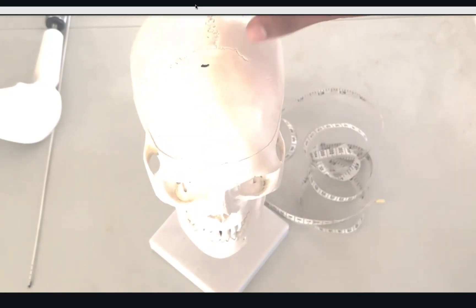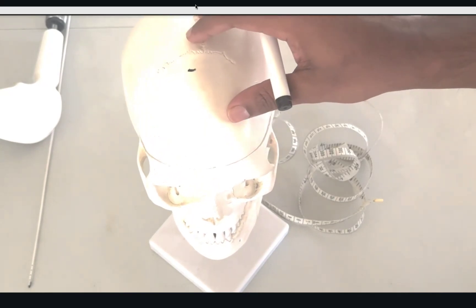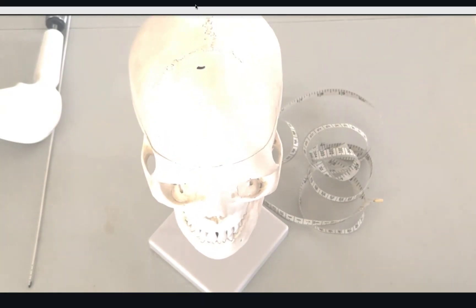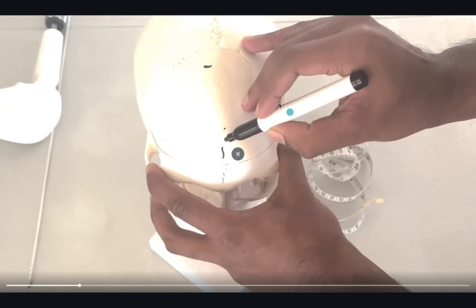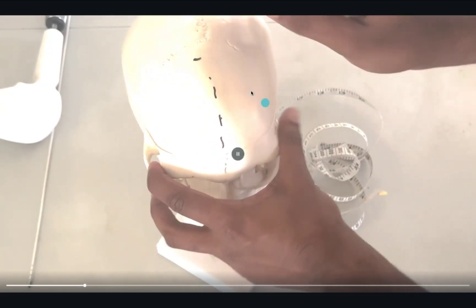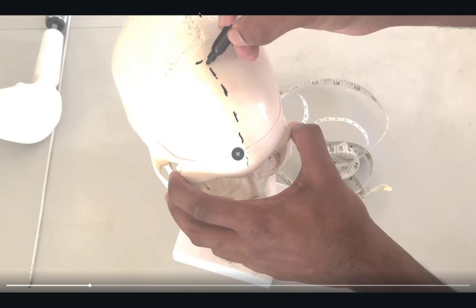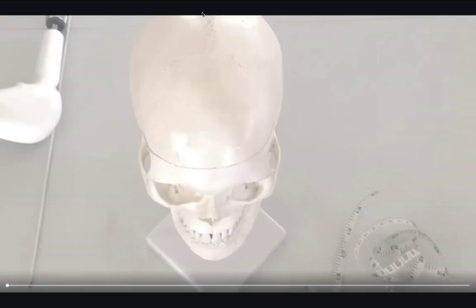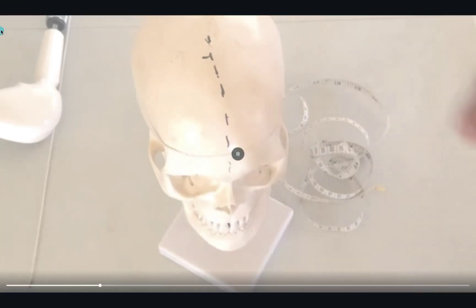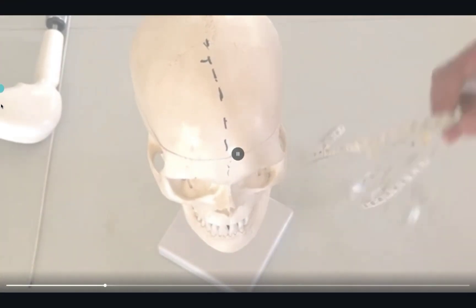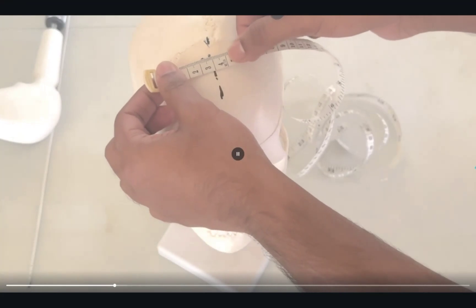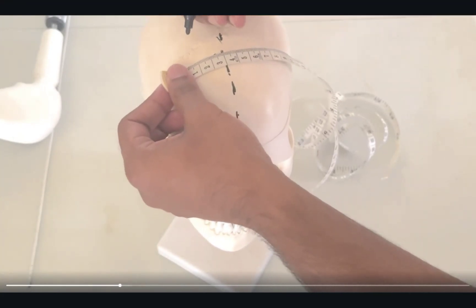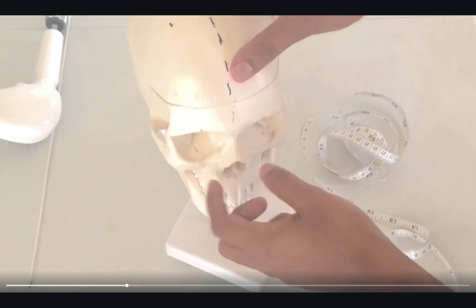It should correlate with being around one or two centimeters from the actual coronal suture. I always find it's a good idea to mark out the midline so that during the operation you would know if you're going to be away from the superior sagittal sinus. Next, you want to be around three centimeters to three and a half centimeters away from the midline. That should correspond with the mid-pupil line, as you can see.